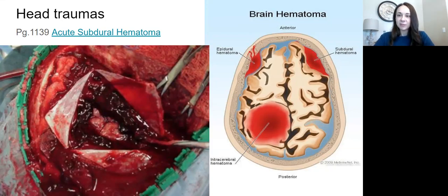They have some metal Raney clips. We actually at our facility tried them before. They stink, they don't work very well. They don't clamp onto the skull. So that's why we use these non-radiopaque ones, but that means they can't be seen on x-ray. That means you need to be extra vigilant with the count. There has been a time where we did an x-ray looking for this Raney clip and it was in that brain bag, underneath a bunch of blood, suture strings, all this nasty stuff. That's why we couldn't see it.